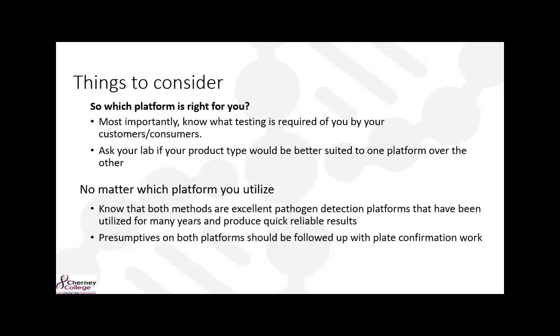So, things to consider when you're looking at both platforms, which one's right for you. Most importantly, you're going to want to know what testing is required of you by your customer or consumers. Some people say, I need this test done via PCR, or some people aren't quite as stringent about it. So just make sure you know what's required of you. Also, it'd be good to ask your lab if your product type would be better suited to one platform over the other if you don't have those types of requirements set in place by your customers or consumers.